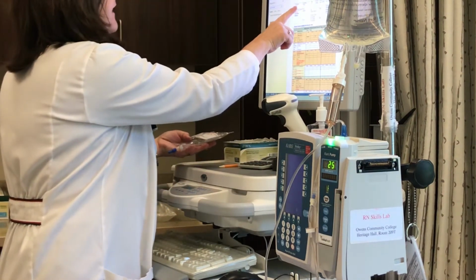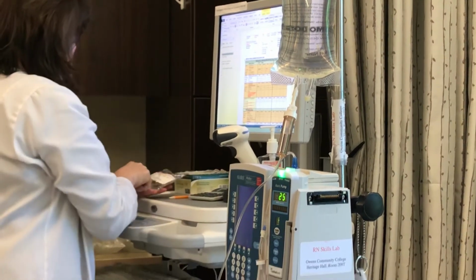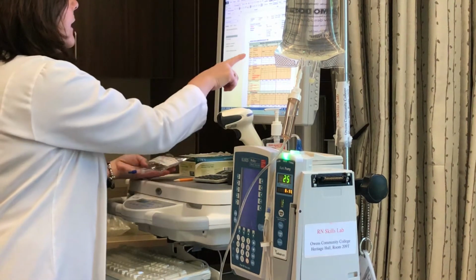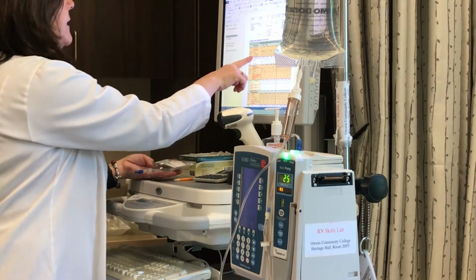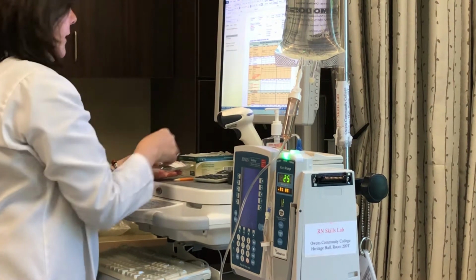My patient is Diane Curtin. Drug ordered is gentamicin, and I have gentamicin. The amount is 80 milligrams. I have 80 milligrams. The route ordered is IV piggyback, and I have the medication in an IV piggyback. Frequency is every 12 hours due at 0800, and it is currently 0800.